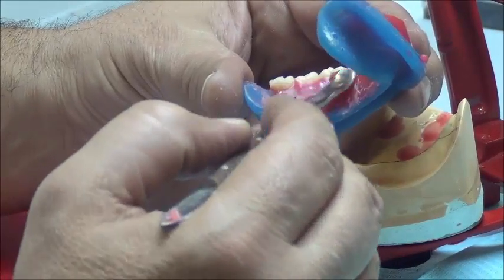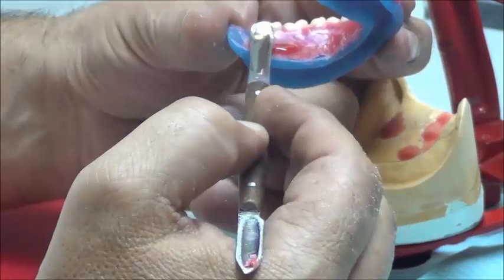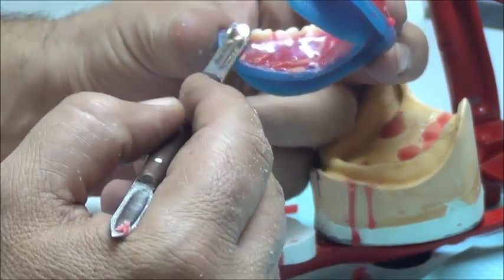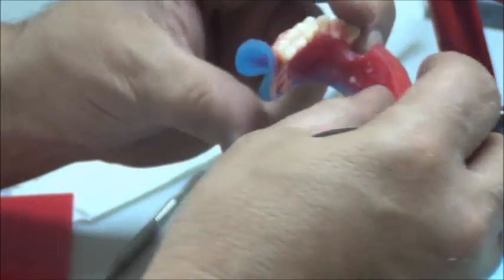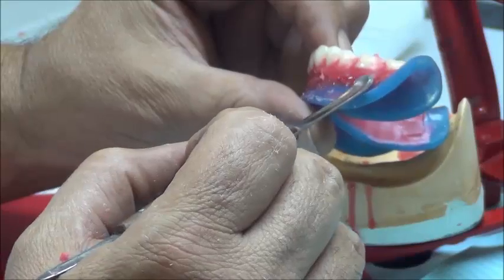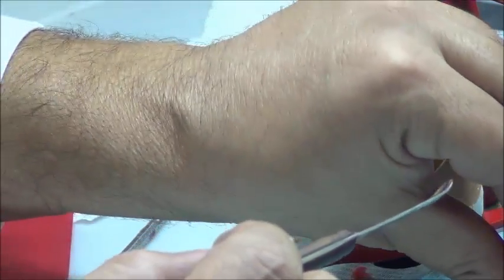So the occlusion is not only composed of teeth position, it's also composed of designing. After we do the wax up of the teeth, adding the teeth in the wax rims, we should also begin designing our denture surface to be smooth and concave and mimicking the gingiva of the patient.